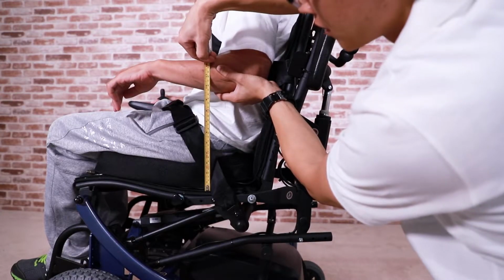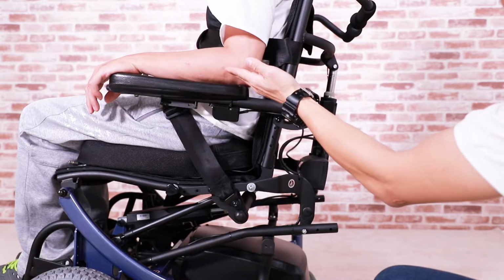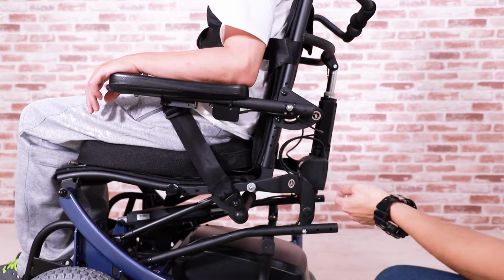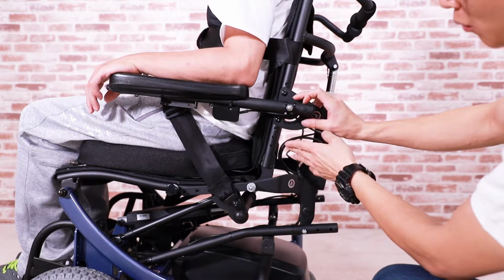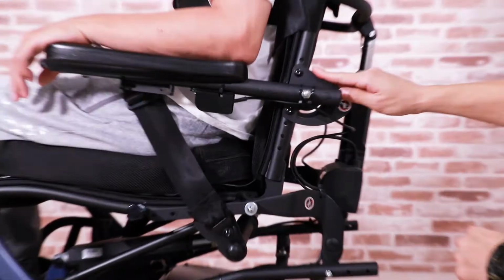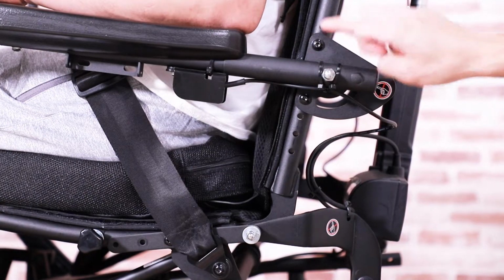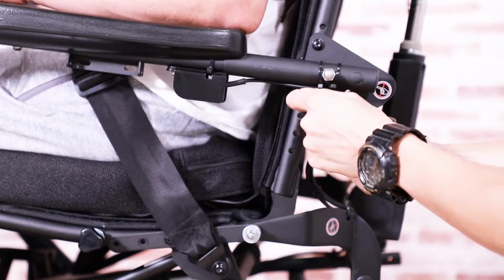After we have the armrest height, we can look at the backrest frame and find the position where we want to attach the armrest. It is easy to adjust the armrest. See these 2 bolts over here? Use tools to open them.